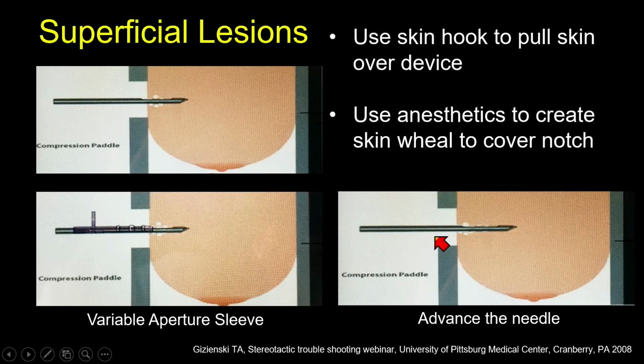You can push the needle deeper to be completely into the breast, and that places the target into the backside of the cutting chamber. But I usually, if I am not sure that my needle is deep enough, I listen very carefully on that first biopsy to hear. If I hear a hissy air leak sound, I stop. Adjust the needle some more.